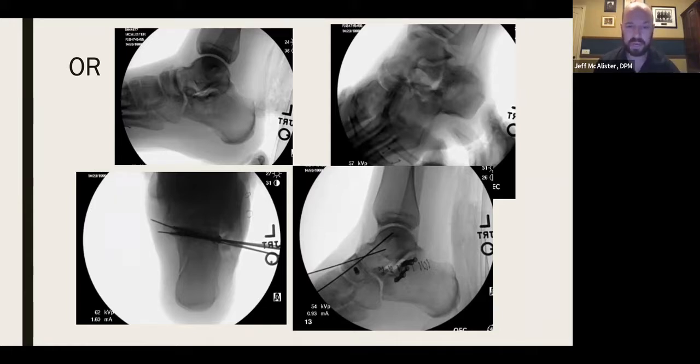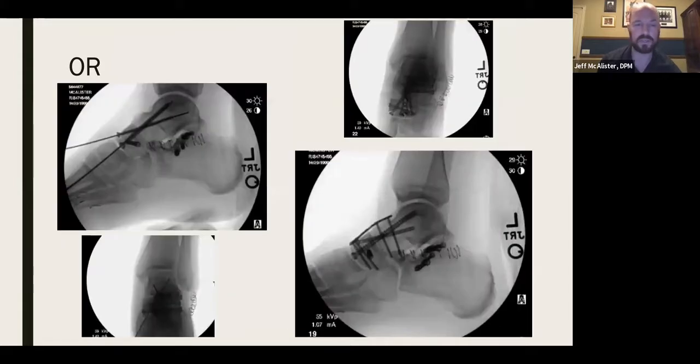Then I said, what am I going to use to pack all these little voids? And how can I get good bony apposition between the femoral head and the remaining aspect of the navicular and cuneiforms and talus and everything else? Obviously we're talking about stable fixation, and this isn't a trauma lecture, but damage control and getting this calc stabilized was our first priority. Then go to the next slide, and then stabilizing his TN joint. So here's where I utilized putty.